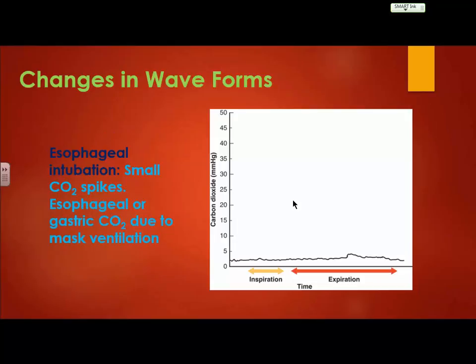What about an esophageal intubation? Well, the first thing that you're not going to expect is what? CO2. What if they just chug down that Coke Zero there? Might be a little bit, but it's going to be an artifacty baseline, and it ain't going to be much, right? There might be a little residual CO2 in there, but it ain't going to be much. But the key here is that you've got to have that waveform. All right?